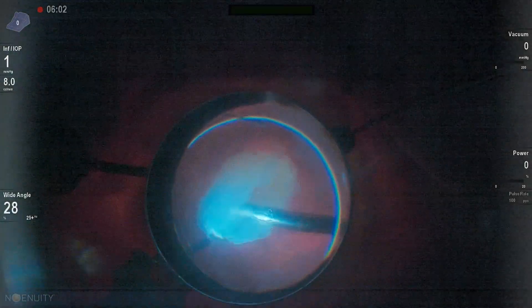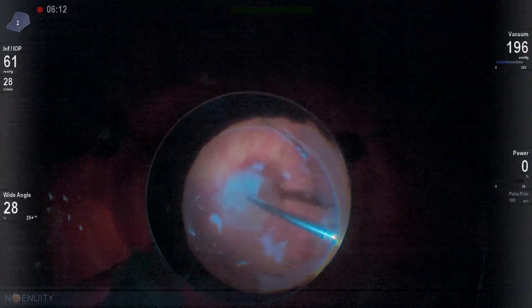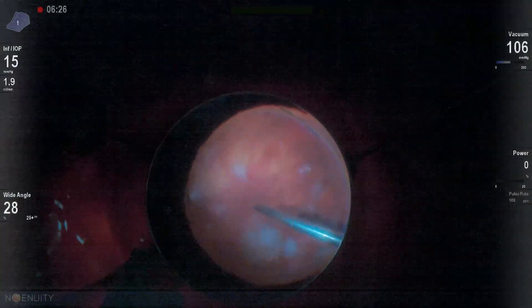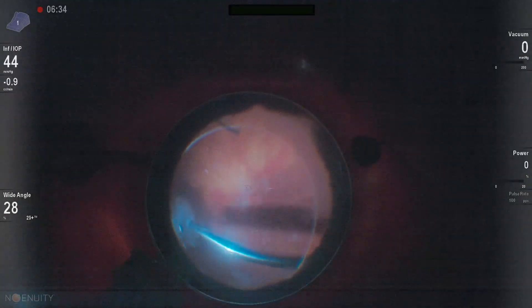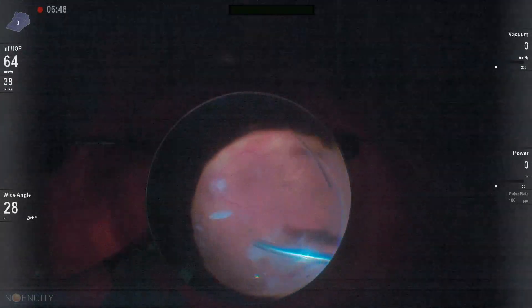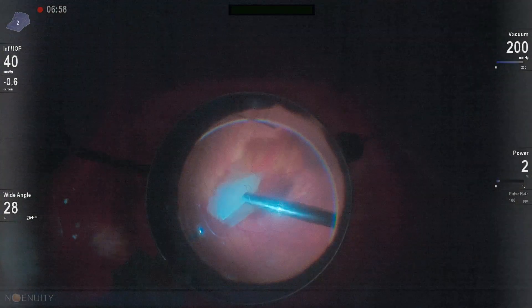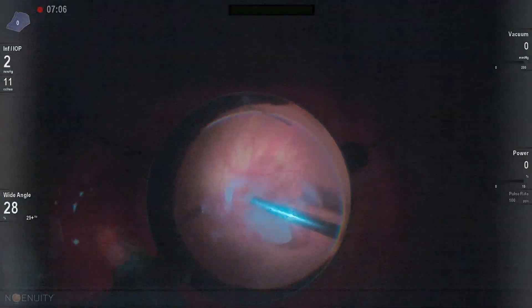I sped this up just about two-fold to get through it, but I wanted you to see an unedited version of us removing the lens fragments and just how efficient this can be. We want to turn the power down so that we don't have a lot of the nuclear remnants shooting off the tip. You'll carve through part of the nucleus and then the other fragments will float away. When the fragments are floating around very rapidly, part of that's enhanced because the video is sped up, but it's really just because we're aspirating.